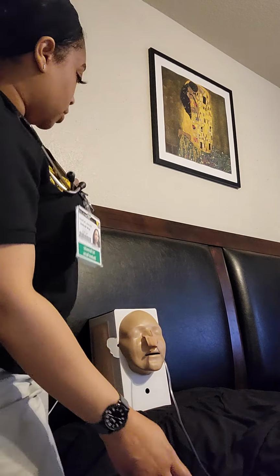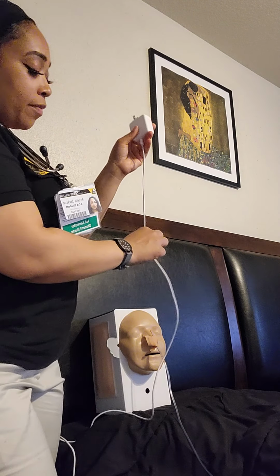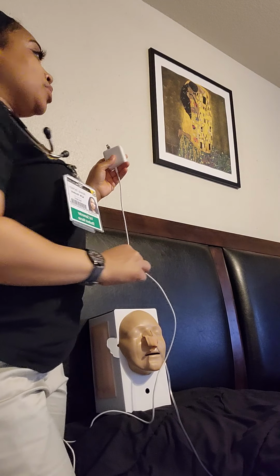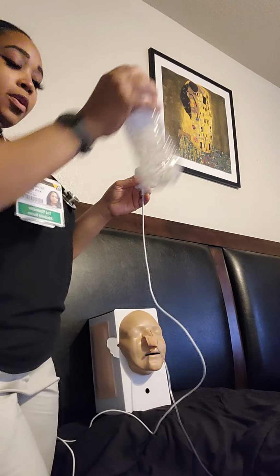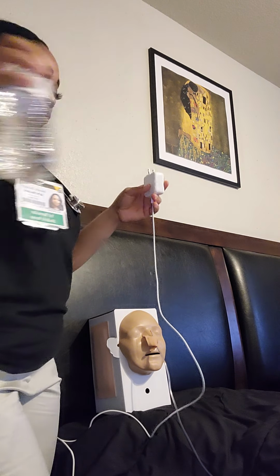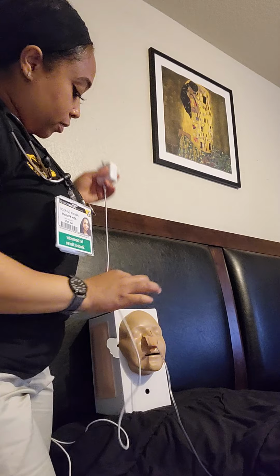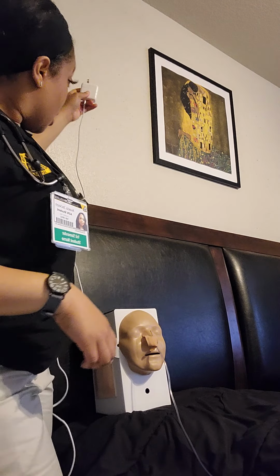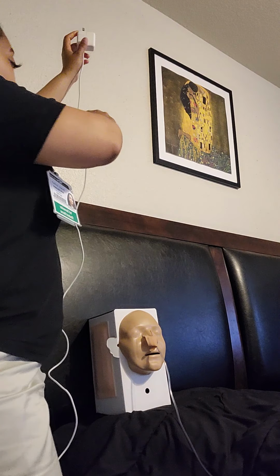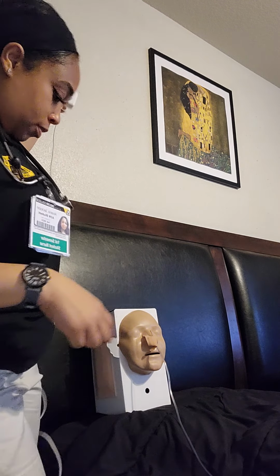I'm going to make sure I have the tube feeding bag closed off, so that way once I pour my tube feeding into the bag, it doesn't flow out. And then once I have the full amount of feeding in the bag, I will hang it up on an IV pole and I will allow the feeding to flow through the tube.